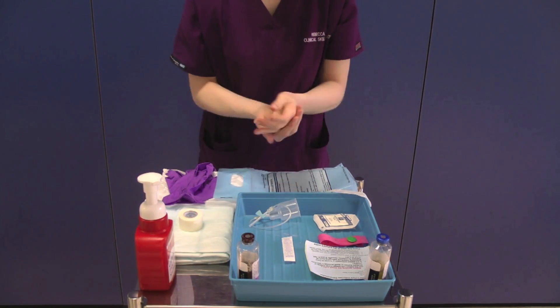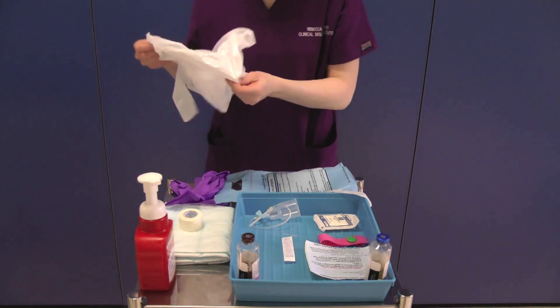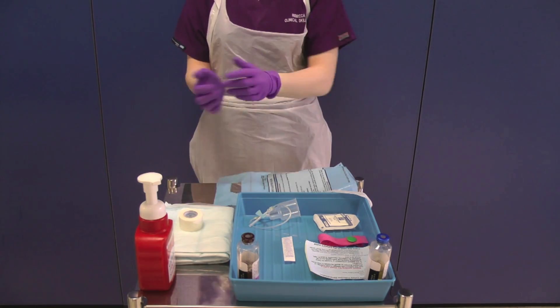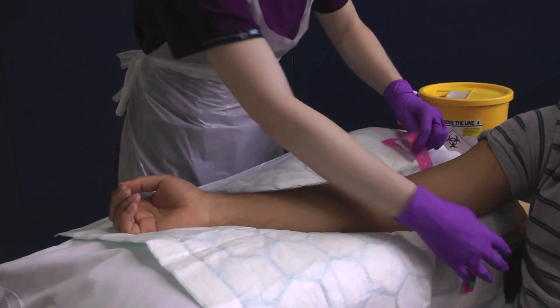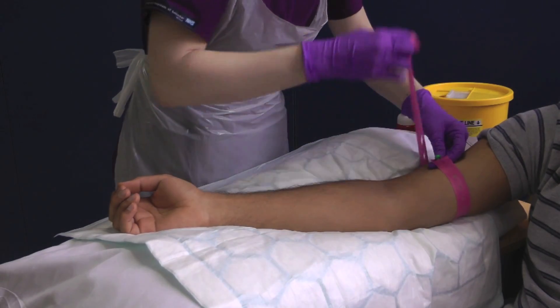Decontaminate your hands and apply an apron and non-sterile gloves. Reapply your tourniquet to distend the vein. Do not repalpate the cleaned area of skin.